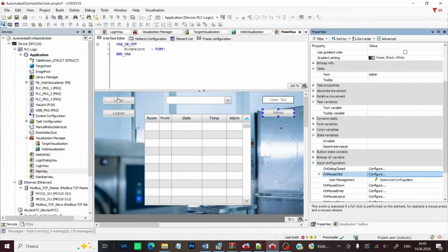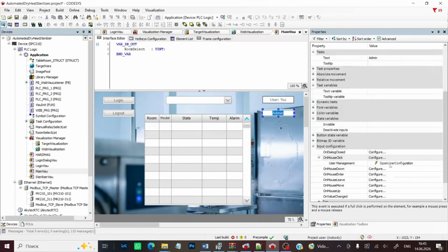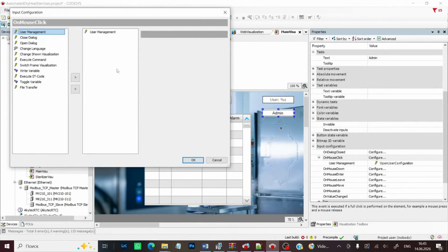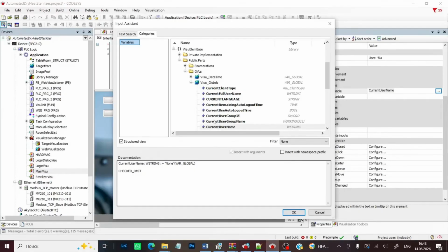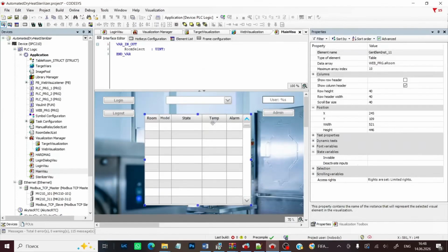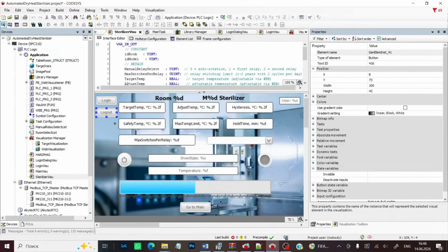In the MainVisu visualization, I added Login and Admin buttons. For the Click Event Handler, I selected the User Management function and the corresponding built-in Authorization and User Management dialog windows. I also added a rectangle component to display the username, where I link the appropriate variable to the text variable field. And I added another column to the table to display the current temperature inside the sterilizer chamber. I added the same components to the sterilizer visualization as well.